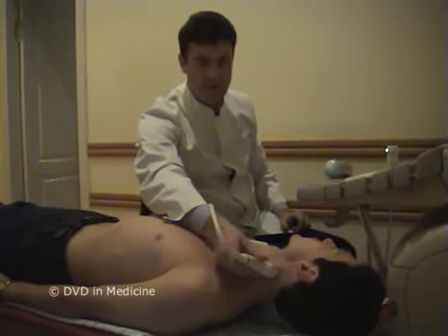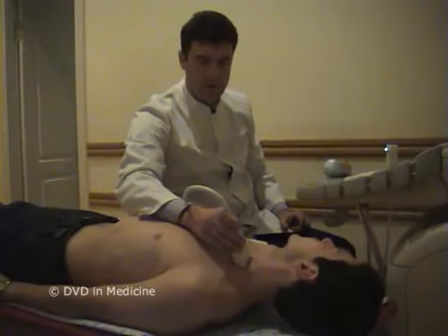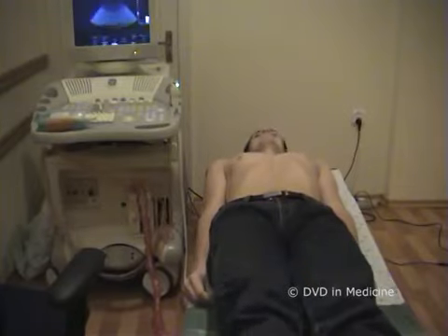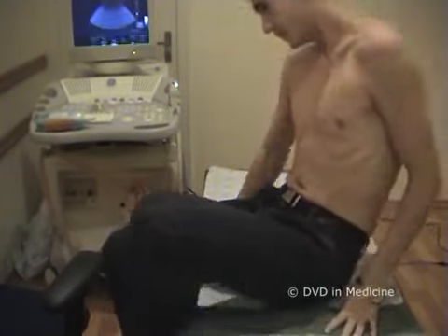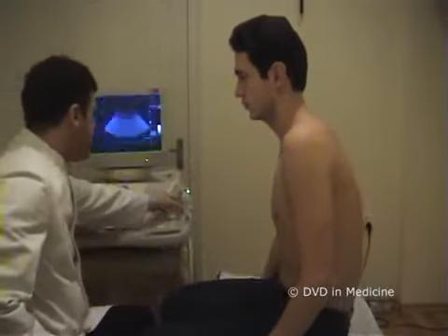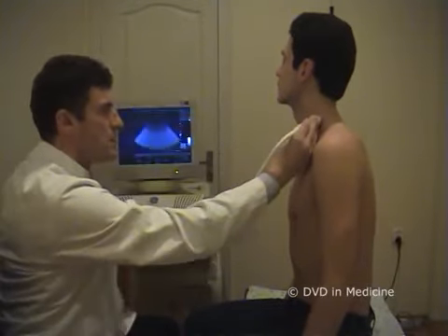He or she will be lying in this position without moving for an extended period of time. Usually, the examiner sits beside the patient's thorax and scans the neck from this position. Some patients may not be able to lie supine. In such cases, they can usually be examined just as effectively in the sitting position. It should be noted that investigating the patient while he or she is sitting will be uncomfortable for the examiner, who must scan the arteries while standing up or with his or her arms lifted in the air.